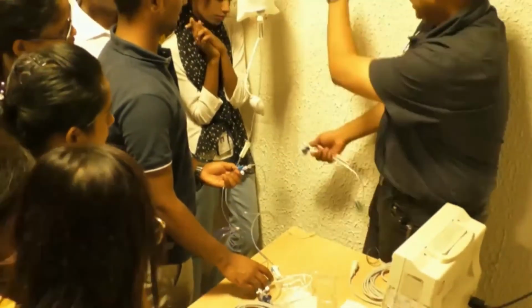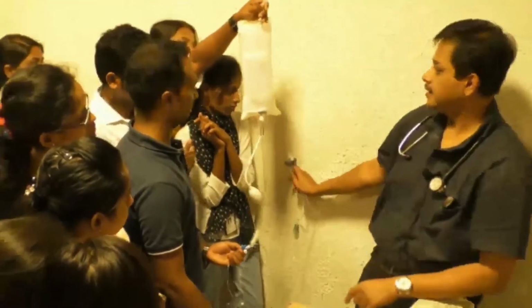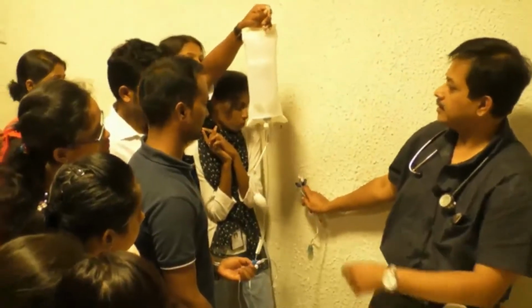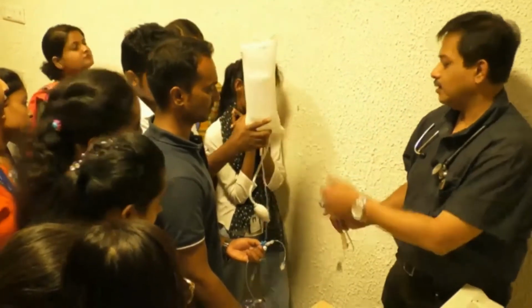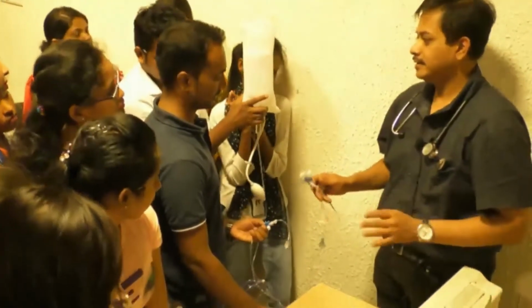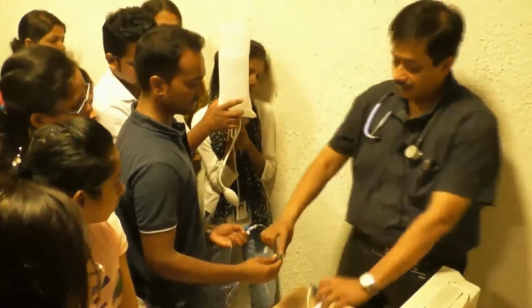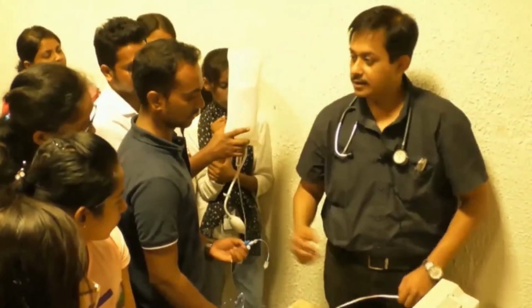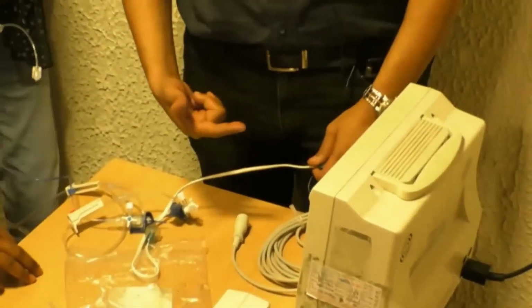It may be often you can see in a stand outside the bed, and there the transducer is attached, right? They are also at the level of the phlebostatic axis. Thereafter I'll open and zero it, right? And now we are measuring pressure, and this is also definitely attached. If there is any doubt whether it's okay or not, then we'll do a flush test. Fine.